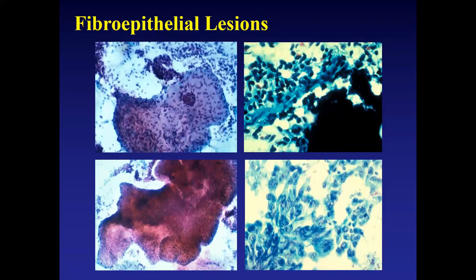And of course, a cellular fibroadenoma can mimic a benign phyllodes tumor, which is much more cellular. There's a considerable component of mesenchymal element in the background, with increased cellularity. For example, this is quite a cellular mesenchymal background. And of course, these are called benign or possibly borderline.